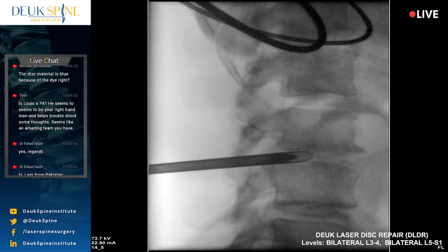Take your time, Louise. Start pulling it back while you're doing that. You may want to rotate it a little more. All right, move it out. Last disc of the day, or of this case.